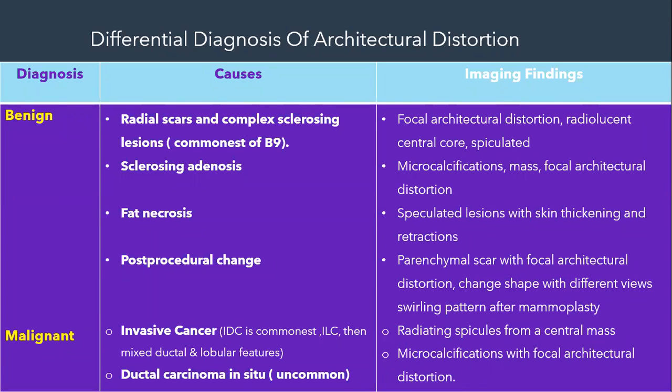As you know, DCIS presents with microcalcifications. Architectural distortion is not a common presentation for DCIS. Usually it is microcalcifications, which might be associated with architectural distortion. Okay.